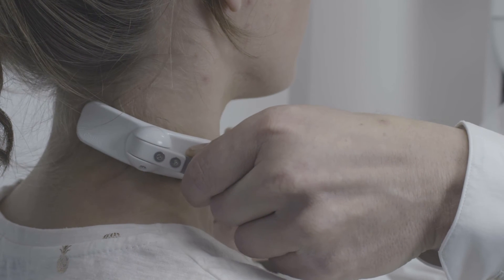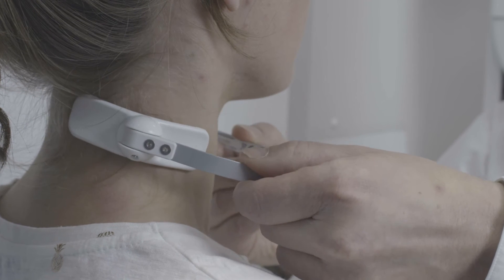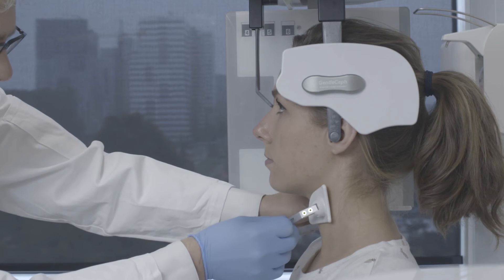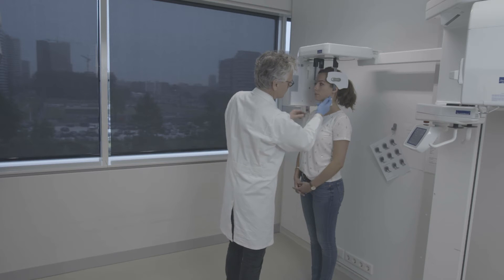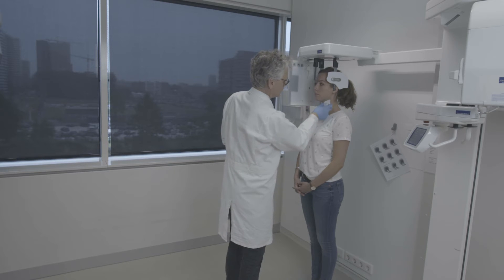The neck rest must be placed on the rear corner of the neck. The shielding part must be placed on the side of the neck where the radiation is incident. To position the shield correctly we must look at the patient from the side.